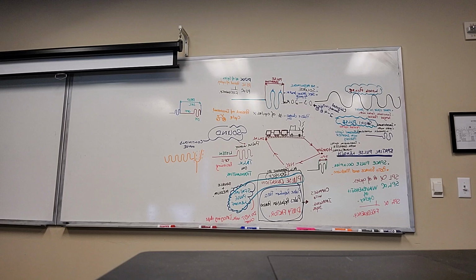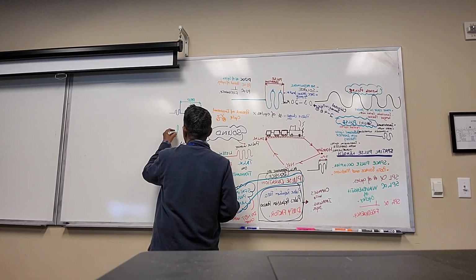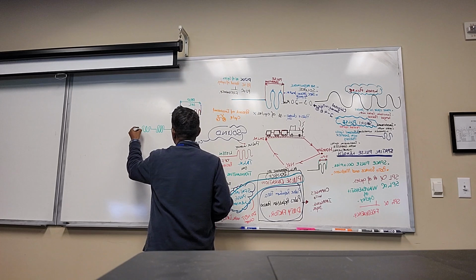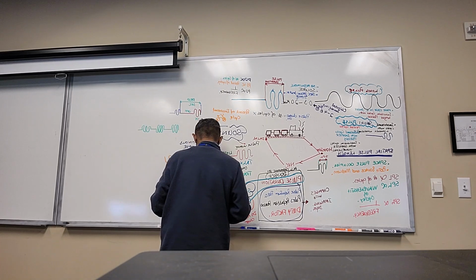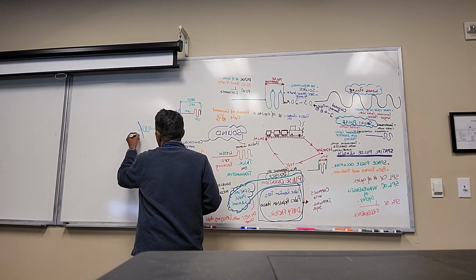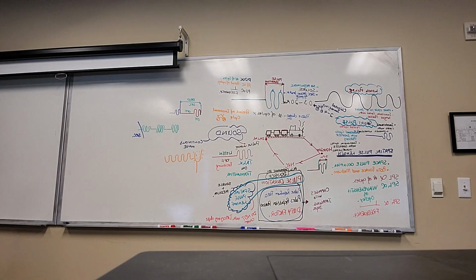It is basically the number of pulses that an ultrasound system transmits in the body each second. Say I got 1, 2, 3 pulses that I'm emitting or transmitting per second.